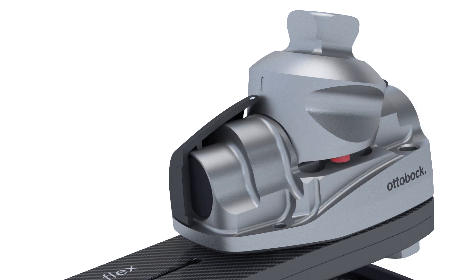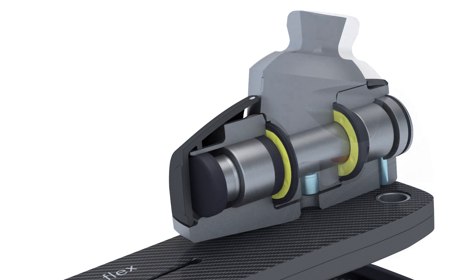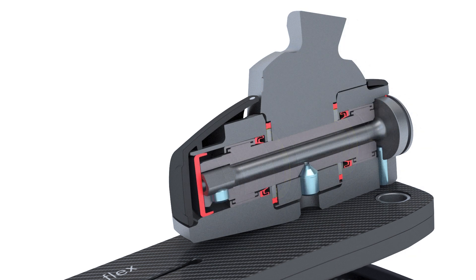Bumpers soften the end of the range of motion. Seals protect the internal mechanics against environmental conditions.